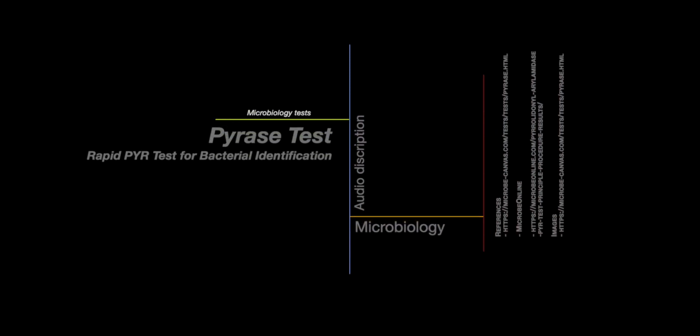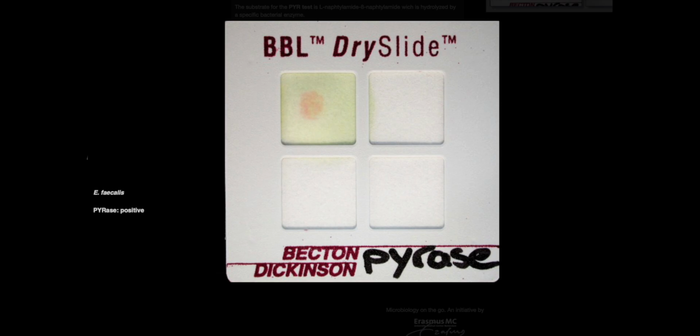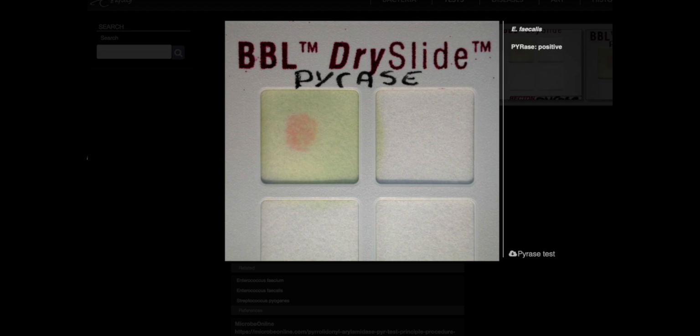Rapid PYR Test for Bacterial Identification. Learn how to perform the PYR test, a quick and easy method for identifying group A Strep and Enterococci. This video covers the principle behind the test, step-by-step instructions, and interpretation of results.